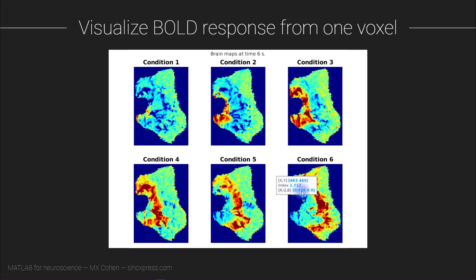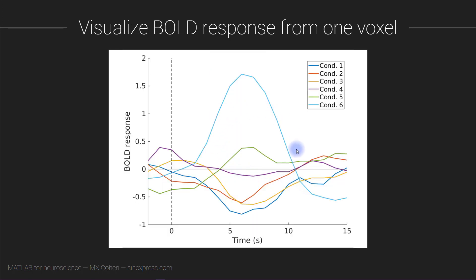This image here — this frame — is one frame in the movie at six seconds, so this is somewhere in the middle of the movie. We're going to redraw this figure at time six seconds post-stimulus. Once we pick a particular voxel by hand, we get that index and coordinate for that voxel and then generate a time course. Each line here corresponds to the event-related BOLD response from a different condition or different stimulus eccentricity.